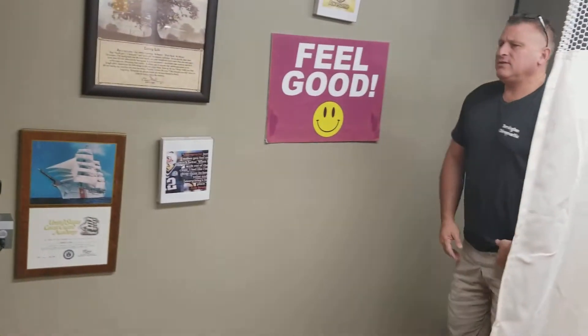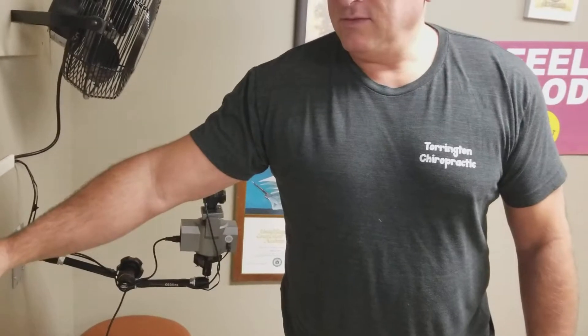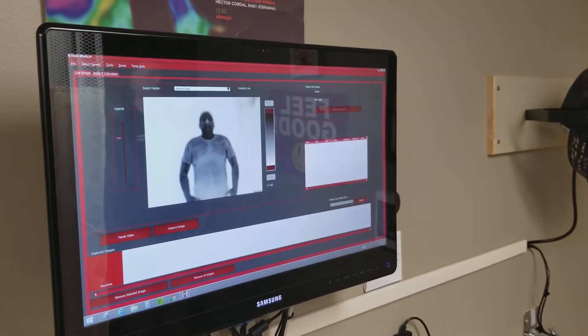Then what we want to do is come back to about whatever distance we use for our full body testing. Of course we have to use the pan and tilt to come up a little bit to get that distance. And as you can see on the screen, that's about the right distance there.